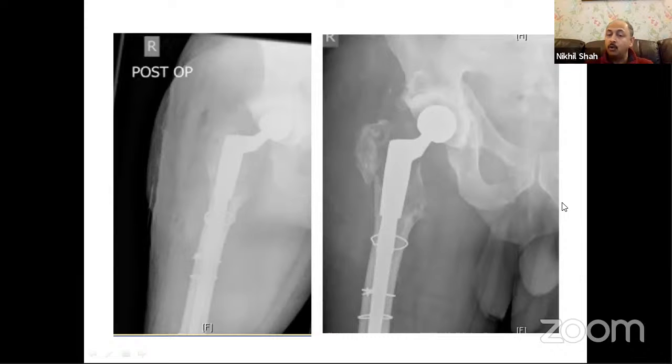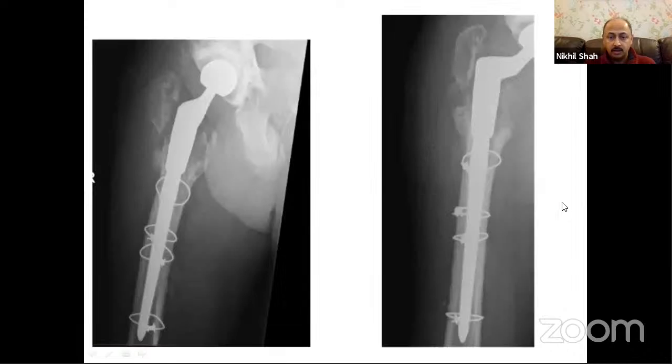So I don't like to put the hook plates on or cerclages, because what I found is the trochanter in these cases is often quite soft and it just disintegrates under the plate. For whatever reason, the infection risk is high and the outcomes are not really very good. So I tend to just ignore it, or to stitch it using a thick suture material, using some drill holes, or just wrap it around and try and keep the soft tissue sling intact of the abductors, the trochanter, and the vastus lateralis. And it does work. You don't often get radiological union, but you get firm fibrous union and with good abductor function.